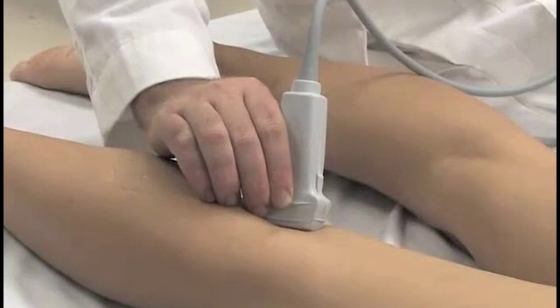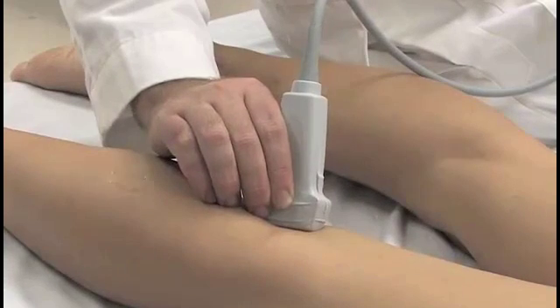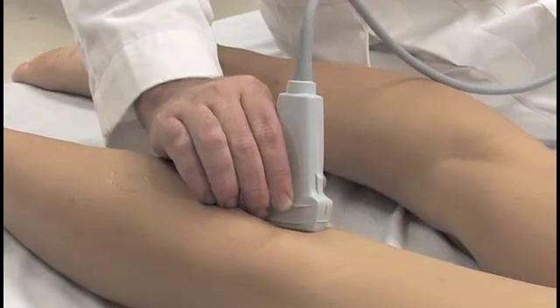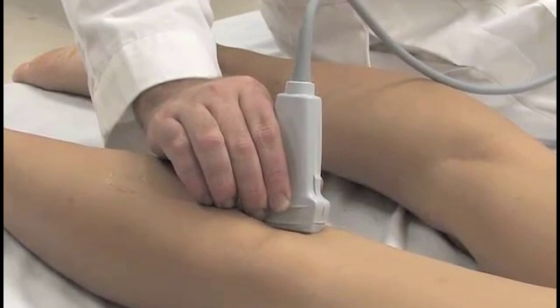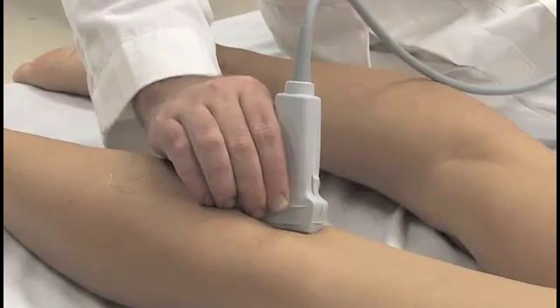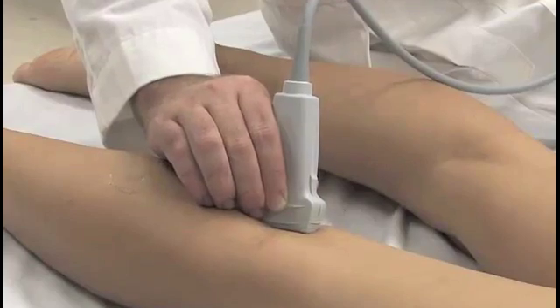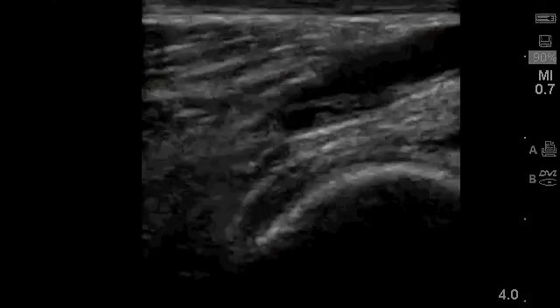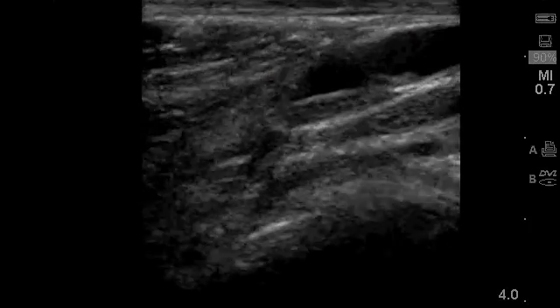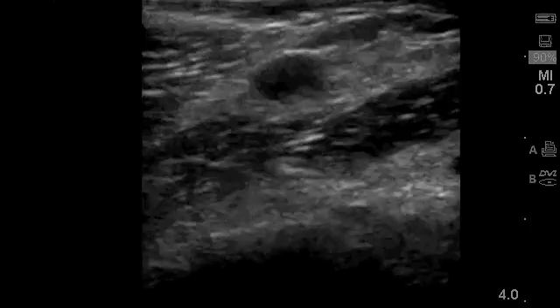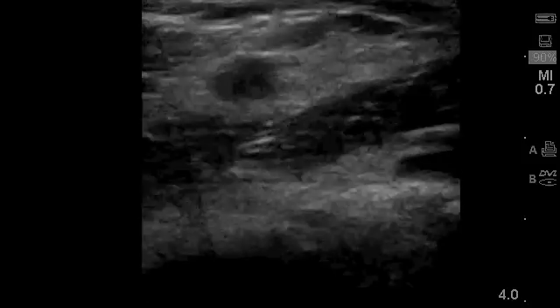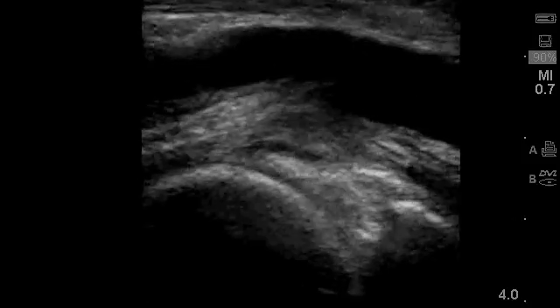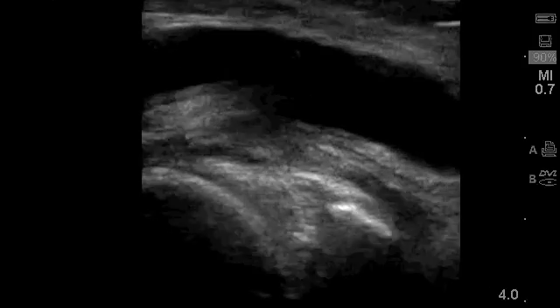If a Baker's cyst is identified, the probe should be turned 90 degrees to obtain a sagittal image and assess its longitudinal extent and look for evidence of rupture. In this view, the cyst typically appears as a larger, more superficial fluid collection, with a smaller, deeper fluid collection separated by the tendon of the medial head of the gastrocnemius.